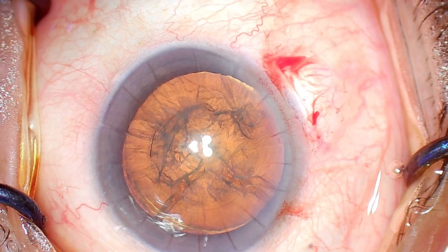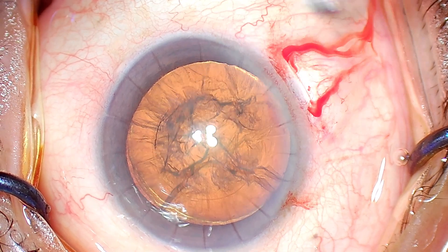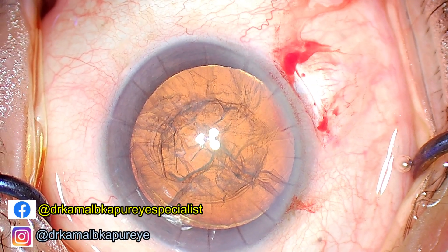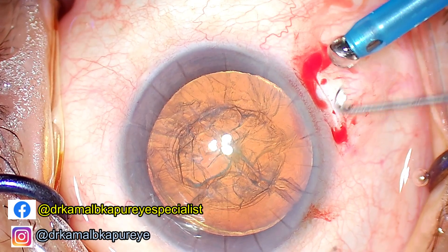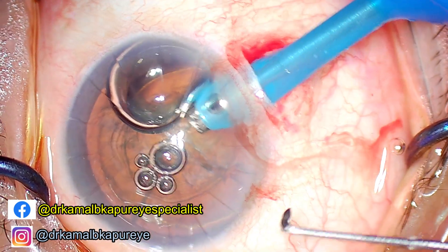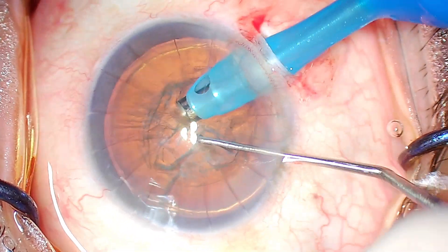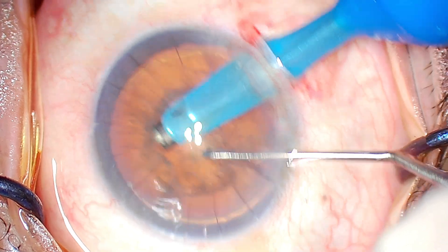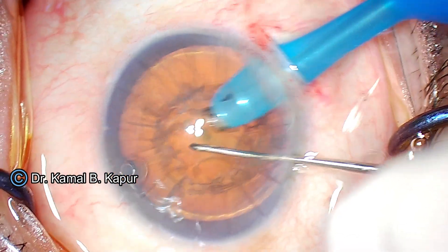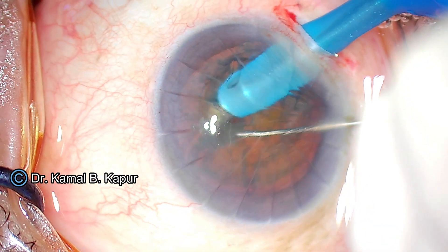This is not a very hard cataract — it is a very soft cataract. Before we enter the anterior chamber for phaco, we instill viscoelastic to distend the anterior chamber and also coat the tunnel of the sclera with viscoelastic. This ensures a smooth entry of the phaco tip and sleeve, otherwise we may cause Descemet's detachment as discussed earlier. Once inside, we proceed to remove the cortical plate and cortical fibers on top of the nucleus. Since this patient is a high myope, there is an increased depth of the anterior chamber.